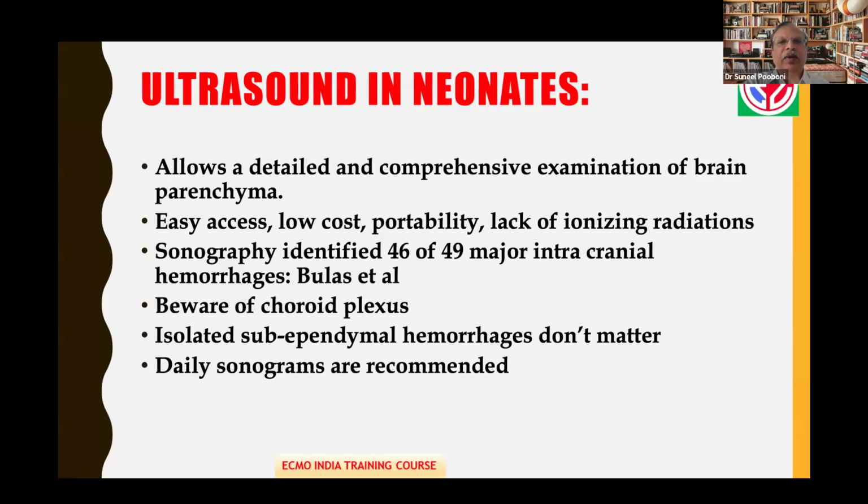Ultrasound in neonates is a very valuable tool, as it is a dynamic tool and can be done many times in a day as well if we need to, in expert hands. It has shown that in 46 out of 49 cases of major intracranial hemorrhages, they were able to identify it on sonography itself without a need for going on to CT scan in neonates. So this is as per Bulas et al. So it depends on the operator sensibility and operator specific criteria as well in identifying an intracerebral bleed.